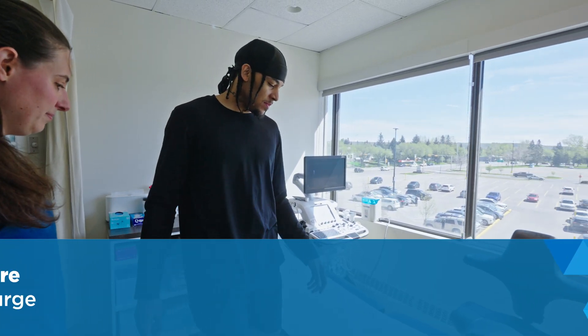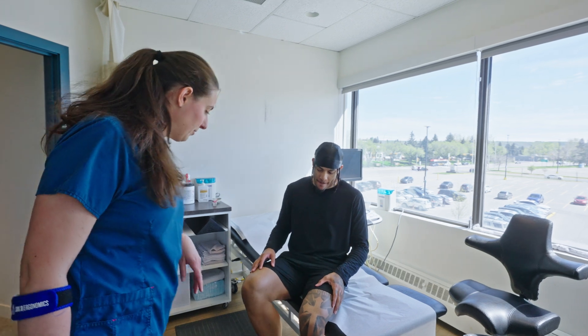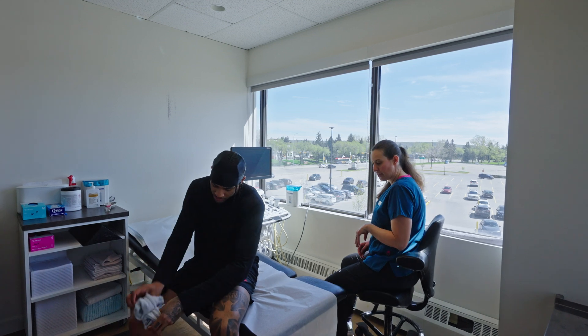I'm going to get you to have a seat on the stretcher. My name is Christine, and we're going to be doing the ultrasound on your ankle today. To start with, I'm going to get both shoes and both socks off. I know we're only doing the one ankle, but I like to take both off just in case I'm going to compare side to side.